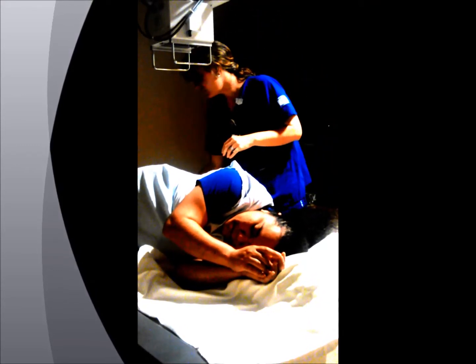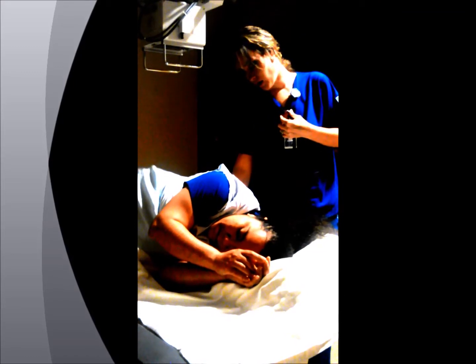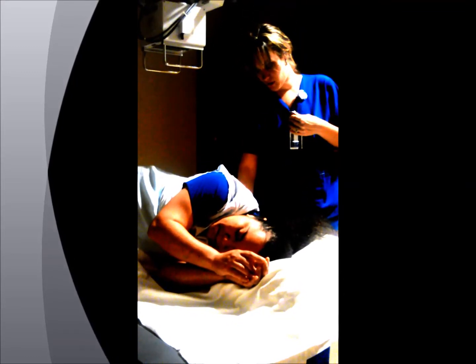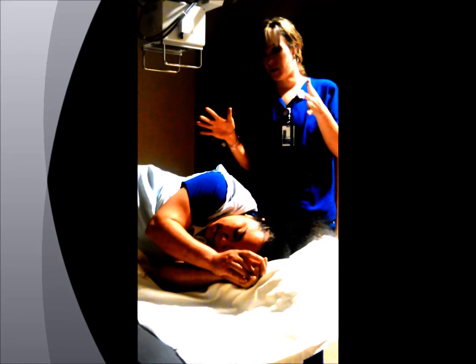And for this particular view, your anatomy demonstrated is your intervertebral foramina, L1 to L4, vertebral bodies, intervertebral joints, spinous process, L5 to S1, depending on the IR size that you use.